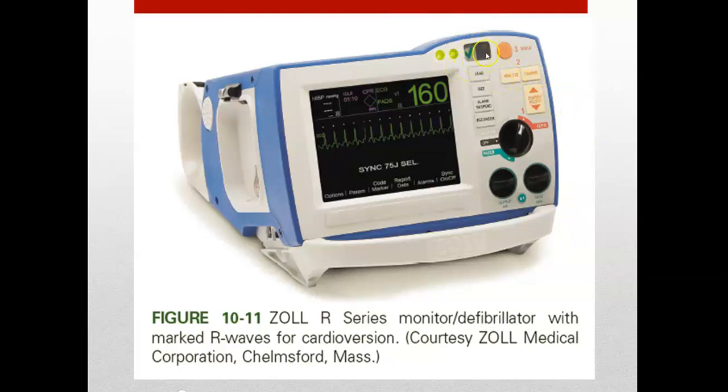This is how we check to see if the machine's working right when we check off. If it's got an X over here, that means it's probably not working right. This is the off button. This is the pacer mode, and I think this says Defib or something along like the code button and stuff like that.